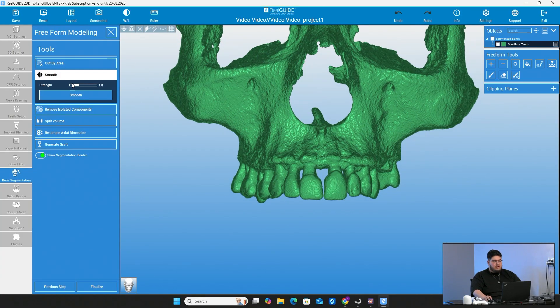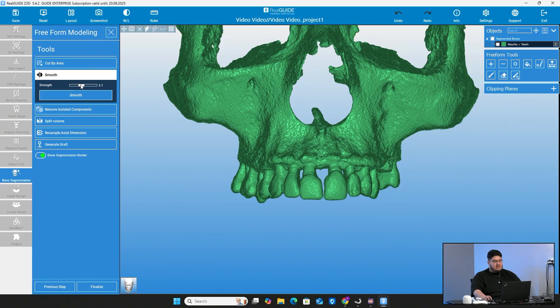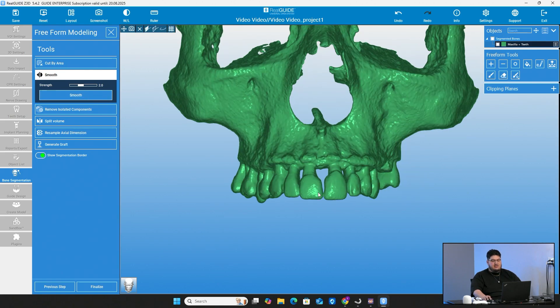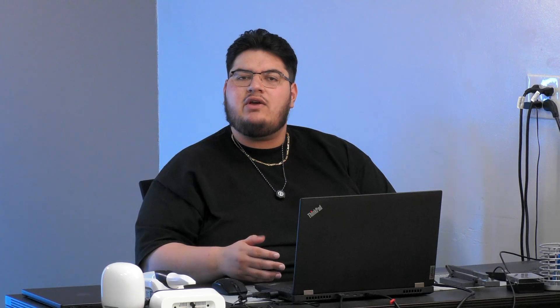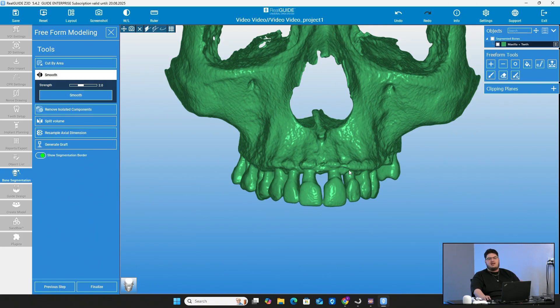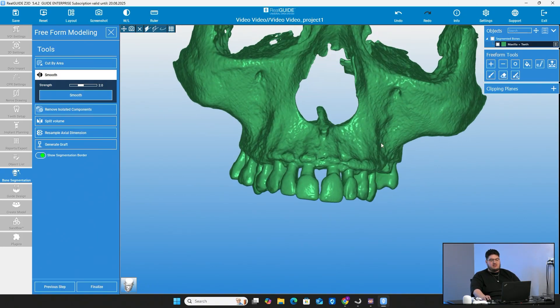What I do like to do is smooth the area, because as you can tell, it's a little rugged. They have a smooth tool right here. I put the smooth strength to about 2, and I go ahead and press smooth. As you see, it just smoothed out the area. It might not be that big of a deal, but depending on when you're making an actual bone reduction guide on this model, the bone hopefully isn't going to be that rigid. It'll be a little smoother. I just smooth it out a little — I don't get too crazy because I don't want to alter the actual look of the bone, especially if a bone reduction guide is going to be made on this working model.